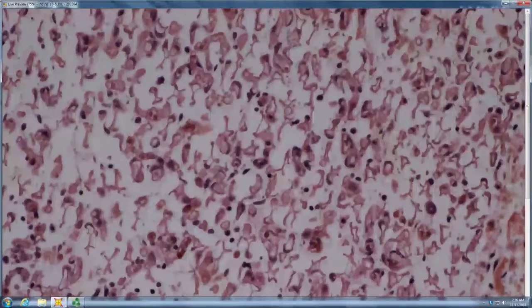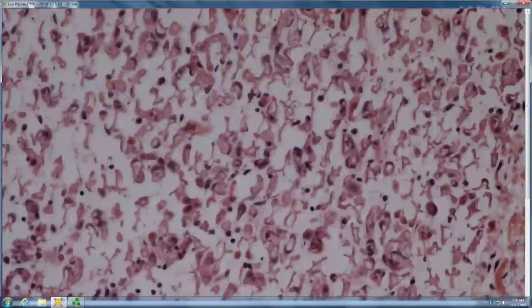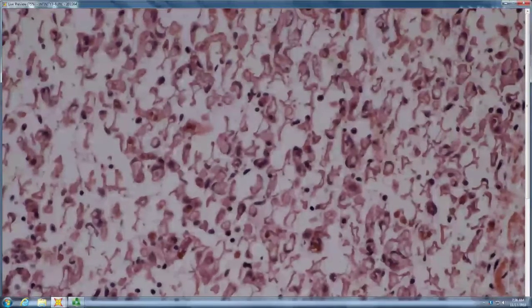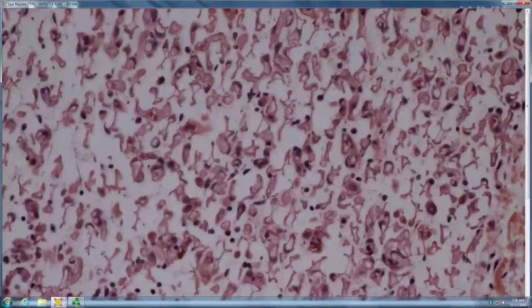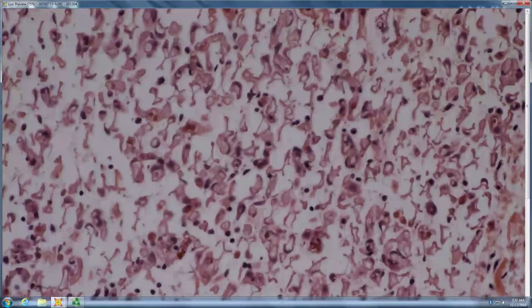Well, no, liposuction removes entire lipocytes, it does not remove the lipid from within the lipocyte. Maybe some kind of injection of a fat dissolving substance. And even there, you tend to get a panniculitis that resolves, like post-Kybella. Whereas this would be A, inflammatory panniculitis, or B, lipoatrophy. B. Yeah, so this is lipoatrophy, which you can get from a number of things.